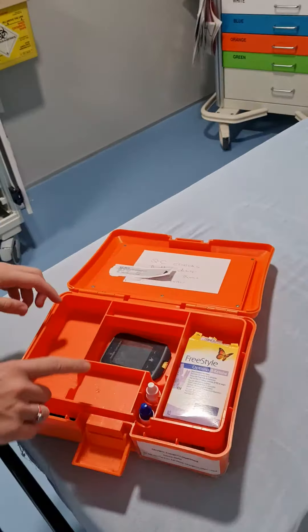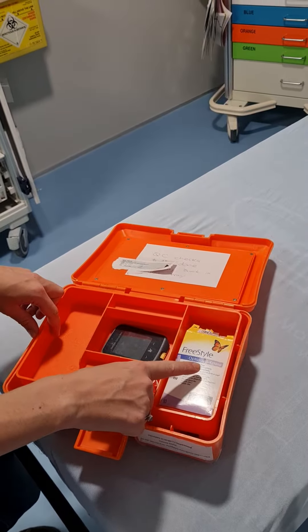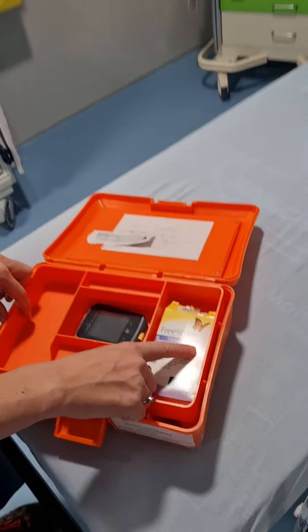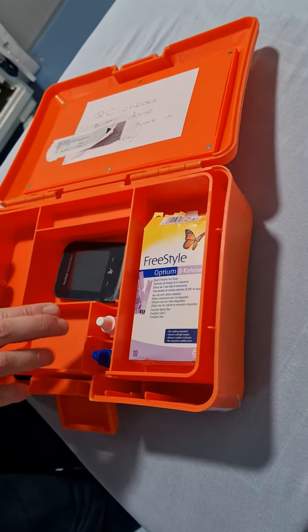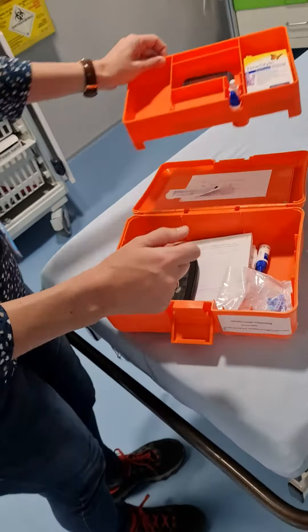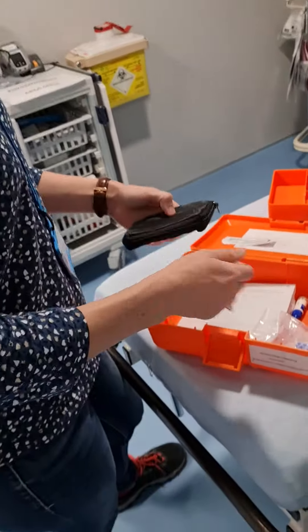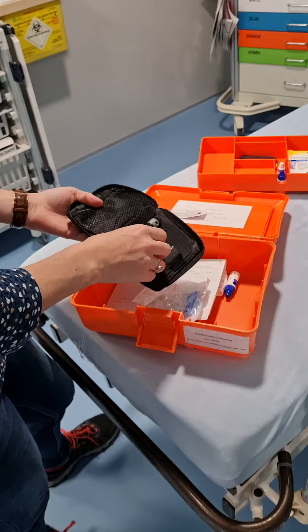Inside we've got our ketone meter and our ketone strips. It's really important that you use the ketone strips, not the ones for standard blood glucose. And then you've got your control reagents — don't worry about those. Inside the box you've also got your lancets and the little device to take the blood sample.